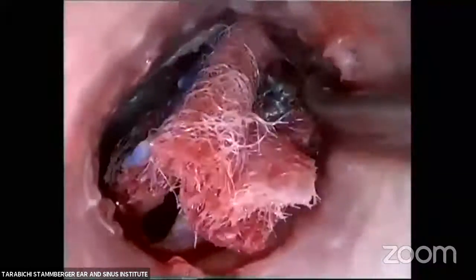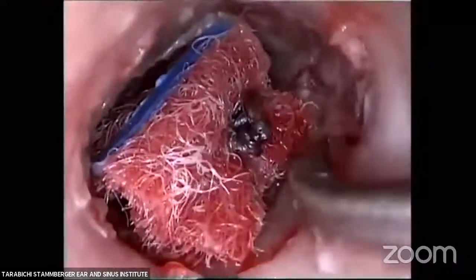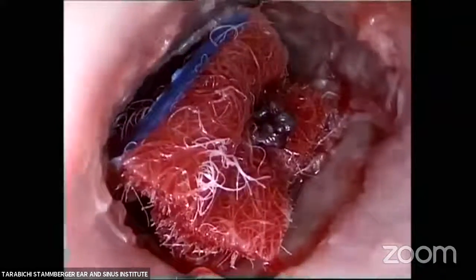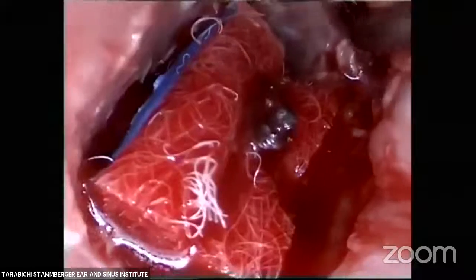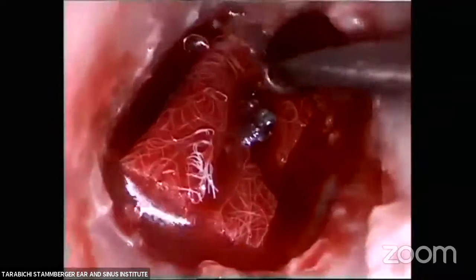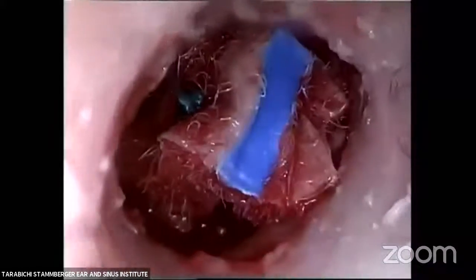You can see how I'm using the suction instrument. And again, I think if there is one instrument, it's very, very important to have. The rest, there's a wide range of suction instruments, but this by far is the most important one in my hand. So I'm just finishing up the cuts. See, 2 or 3 pledgets at a time.